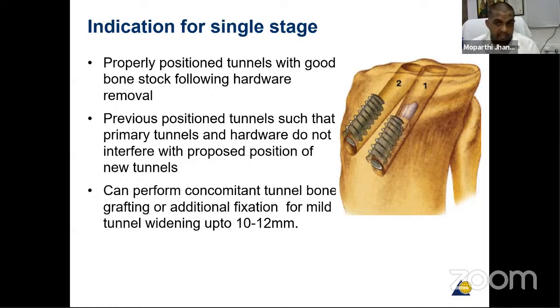You can make a tunnel in the anatomical position. If you want, we can go with additional fixation, with anchors or with washers. It is the surgeon's choice, that depends.